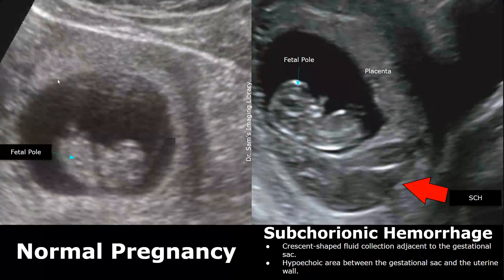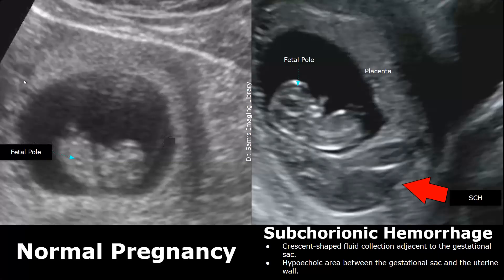Some hypoechoic and heterogeneous areas are seen around a normal gestational sac. They appear because of decidual reaction, in which there is thickening of the endometrium around the gestational sac. Another reason they appear is because of implantation bleeding, often seen in early pregnancy, as the embryo implants into the uterine lining causing bleeding. So the presence of some small hypoechoic and heterogeneous areas is normal — these areas are small blood clots, the endometrium, and blood vessels.